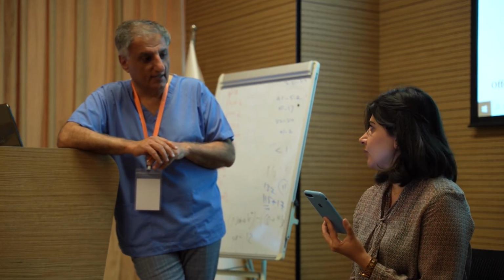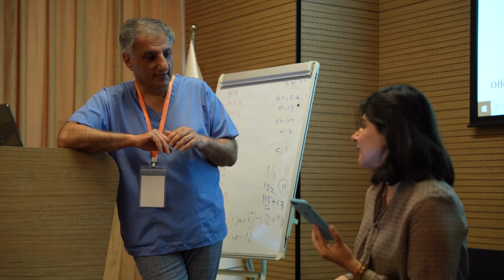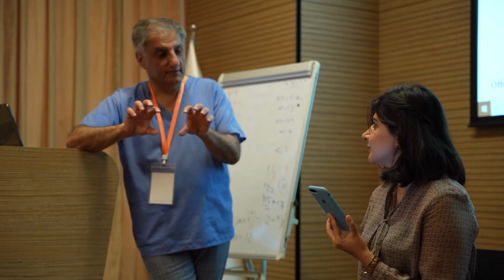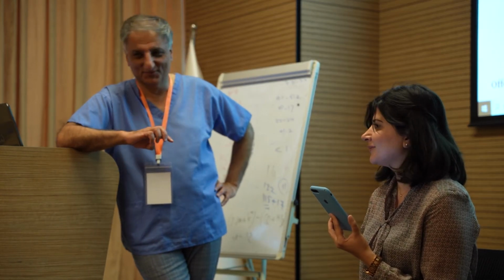First degree heart block? No. We think of atrial fibrillation, but that is irregular, and here we have regular. It's something to do with the atrium, but it's not fibrillation.